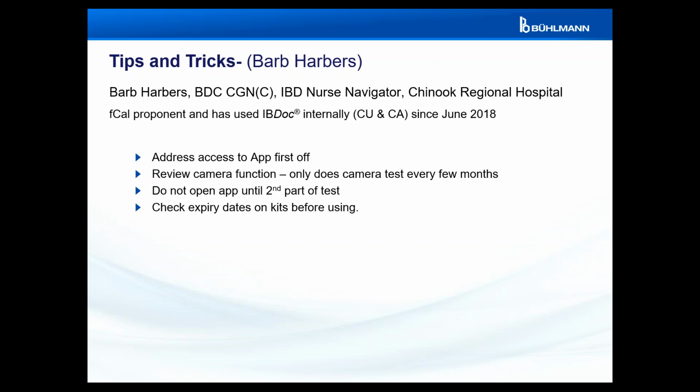And with very few exceptions, patients were definitely interested in having this option, whether they lived in town or were in a rural setting. They could see the benefits of the program in having a little bit more control in their disease and a better understanding of what was going on in their own disease process. So I believe right now I have about 92 patients enrolled in this program, and there's only 6 or 8 that we haven't been able to get working in the program, and that's mostly due to phone issues as opposed to anything else.